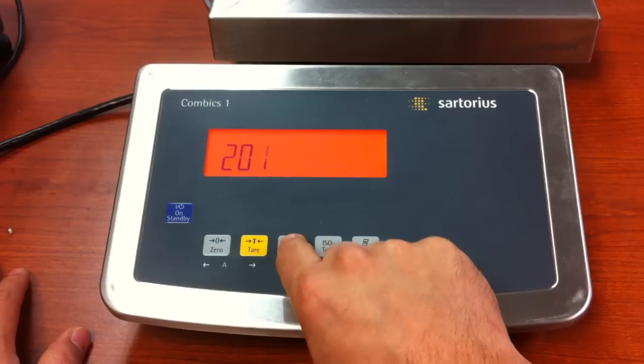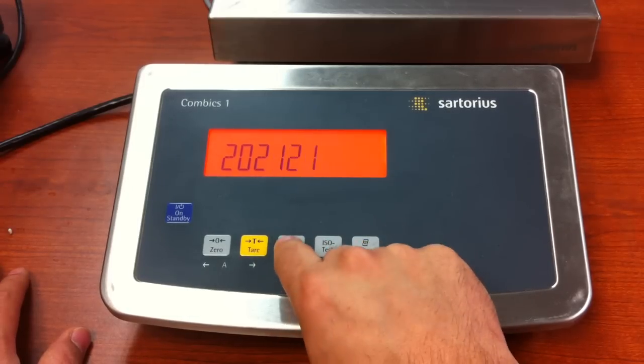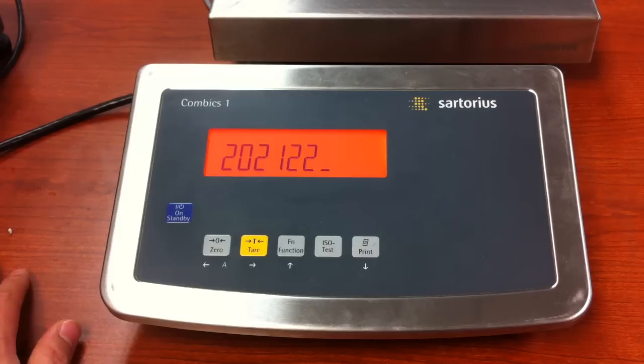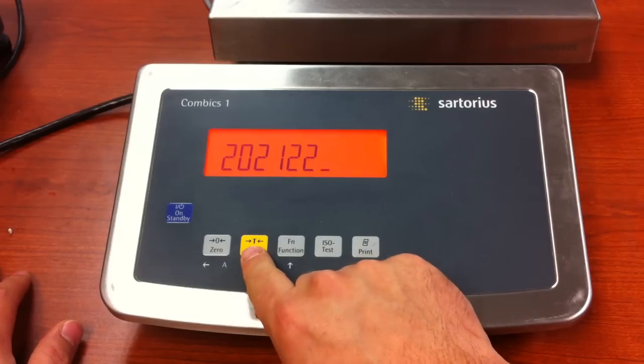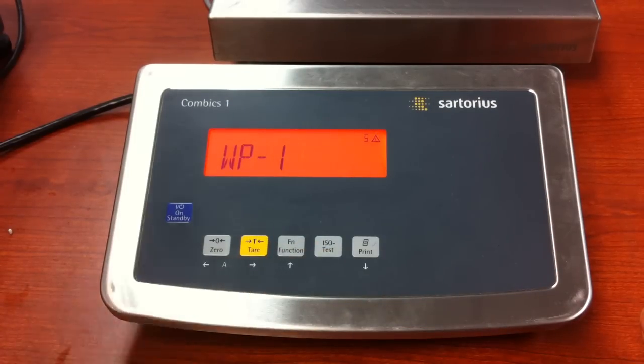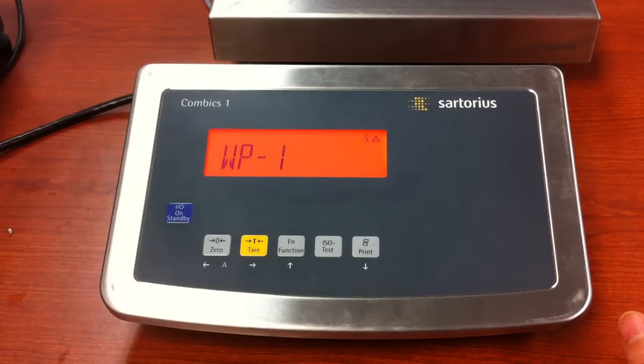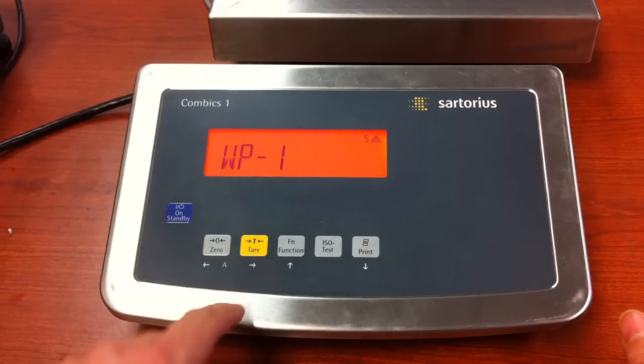The service code is 20, 21, 22. But like I said, if you are dealing with a brand new unit, you will be able to bypass this. So when you go to setup, it will go right to WP1. If it does not, just press and release the function key until you see WP1, and then you will be at this point here.